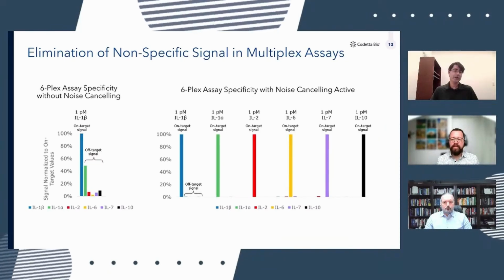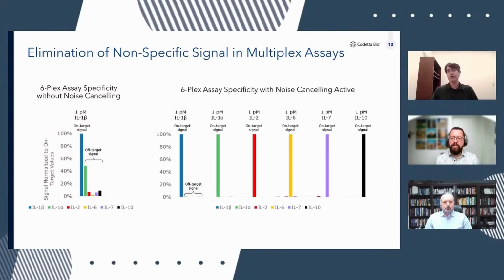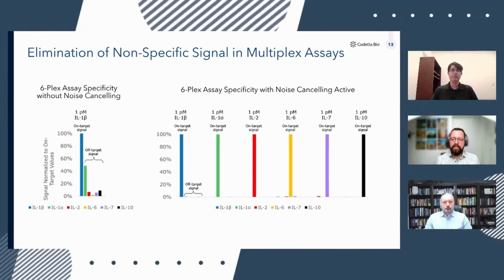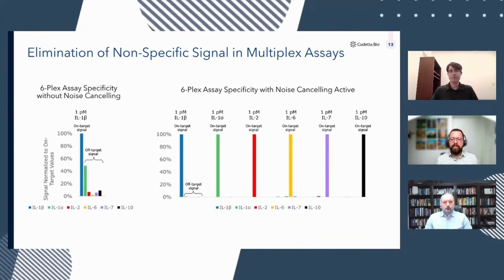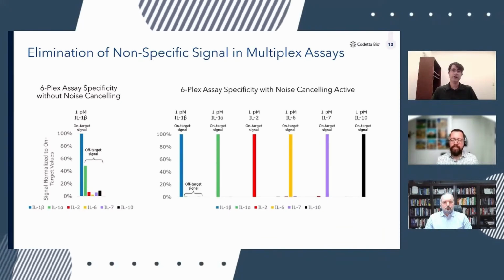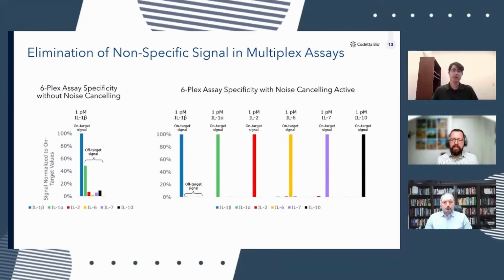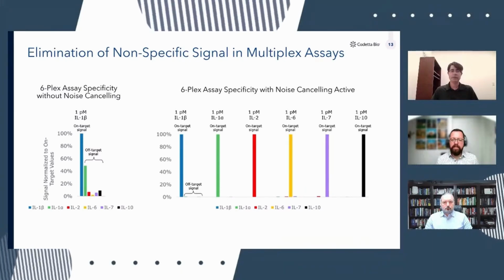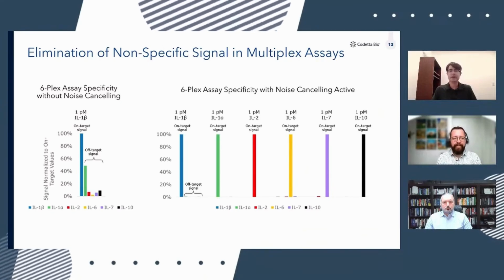And you see that we get a nice signal for where we expect to from IL-1 beta, but we also see, in this case, a fair amount of nonspecific binding from other targets that are not present in that sample. So this illustrates signal that occurs due to nonspecific interaction between antibody pairs, which obviously creates challenges when developing multiplex assays to control for specificity while still maintaining sensitivity.